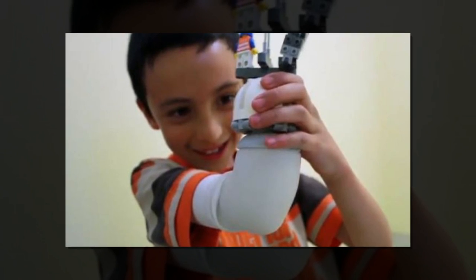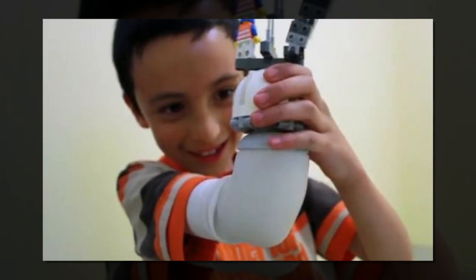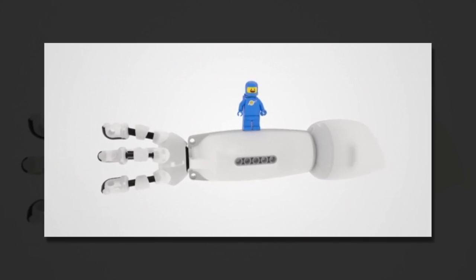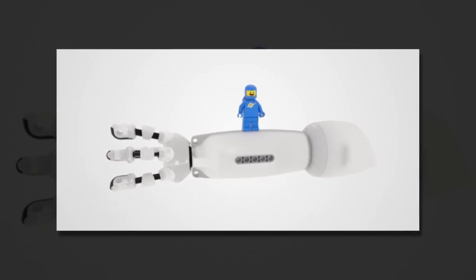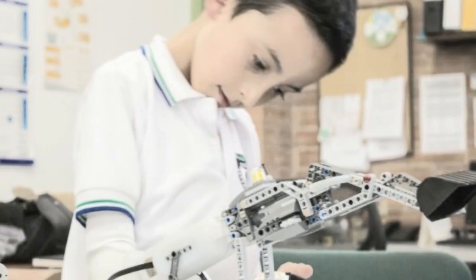This means not only can the wearer build cool Lego things, they can build cool robotic Lego things. The prototype was tested by a little boy named Dario, who was able to control a Lego backhoe, and build a spaceship and Lego grippers attached to his arm using the myoelectric sensors.